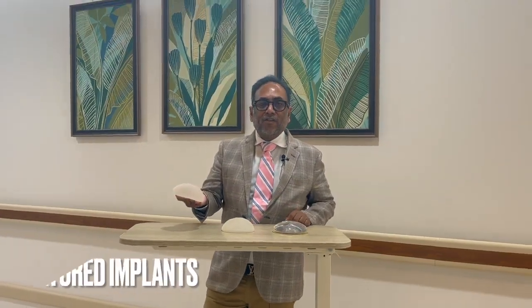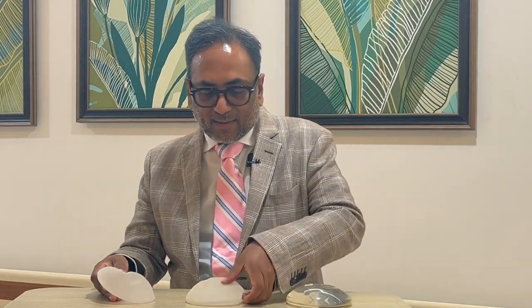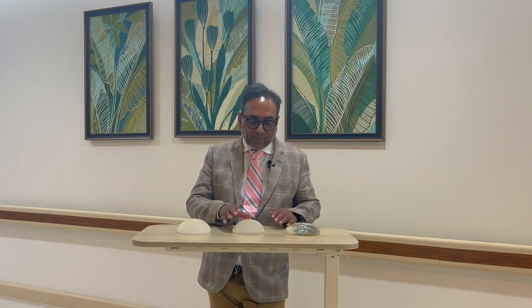And then you have this implant. It's got a micro texturing. Now, if you compare the two implants, this is smooth. There's no texturing at all, and this implant has more texturing. And if you see this, this is micro texture. So previously, what was believed was that the texturing reduces the body's tissue reaction and thereby causes the capsule to be thinner and causing no capsular contraction. So that was the purpose of using the textured surfaces.